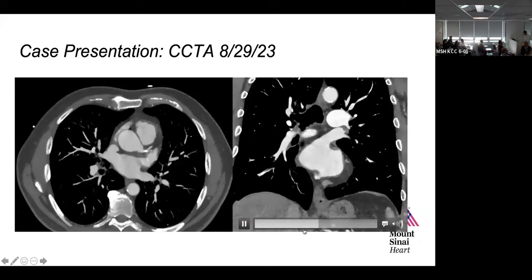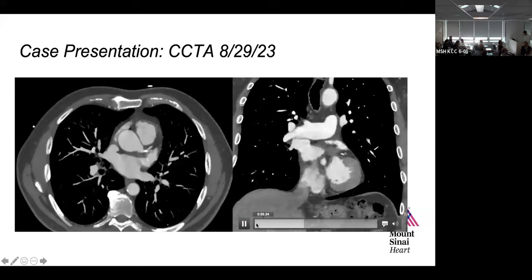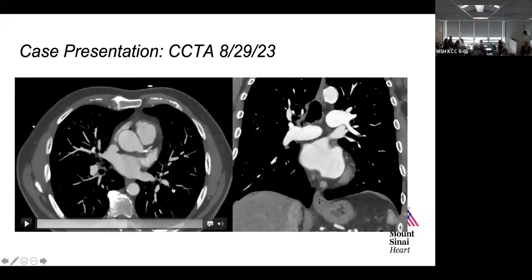So I would just point out on your axial view, you show the defect pretty nicely. You have it frozen on the axial view right there. So this is the defect, and behind the defect is the right middle pulmonary vein. We always emphasize to our fellows that, heuristically, these veins are connecting normally to the left atrium. They're just draining anomalously, right? Because of that deficiency in the wall.